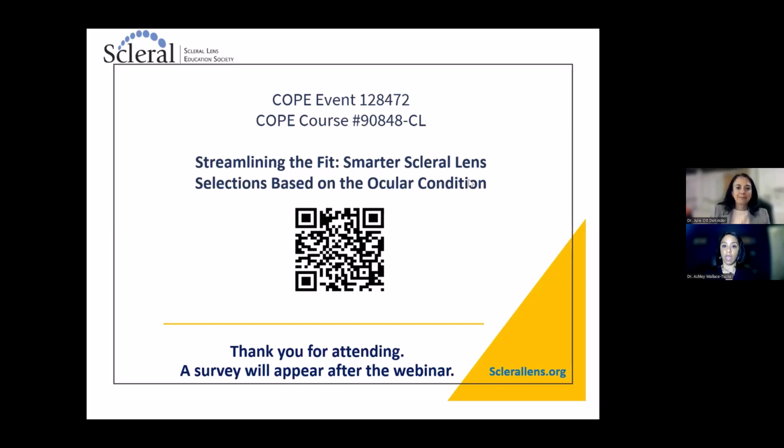Got it. Let's see, there's several here. Would you use an oblate design for a regular cornea with a high minus Rx? Yeah. If that's what you need to get it to fit well, especially if it's one of the flatter corneas. If they've got a flatter cornea and you like an oblate design, the way it looks better and it gives you the limbal clearance you want, absolutely nothing wrong with them.